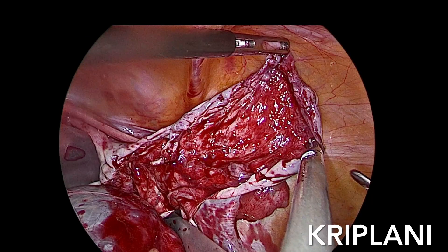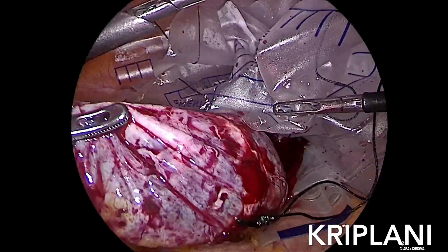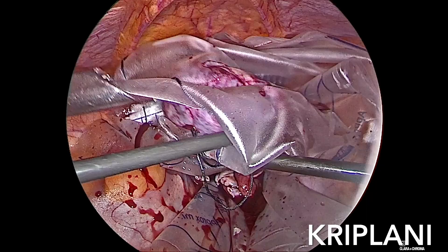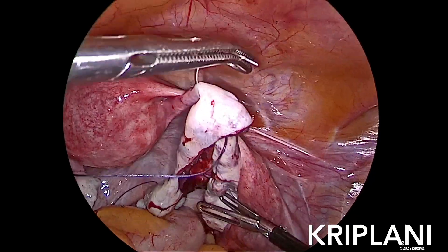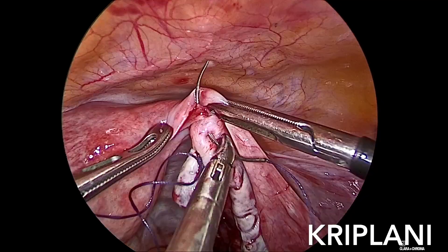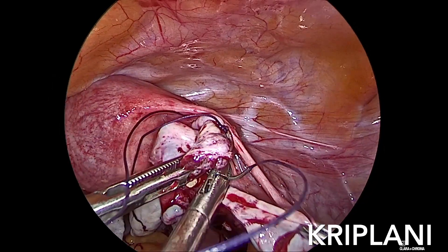And then this is the normal ovarian tissue seen here. Another urobag is put in where this dermoid is removed in order to avoid any spillage. These urobags are very cheap and very strong, so they are near ideal and come out to be cheaper as compared to professional bags.